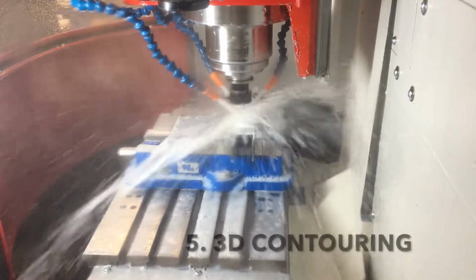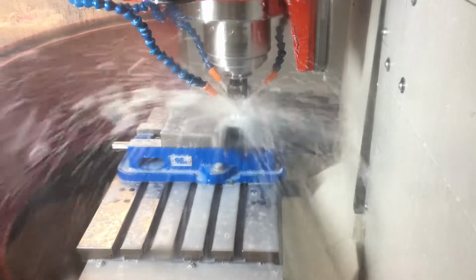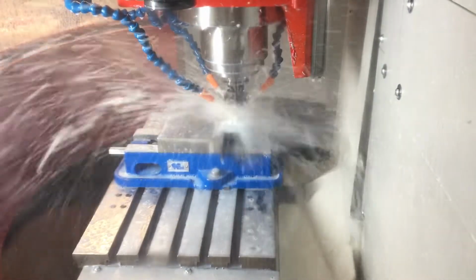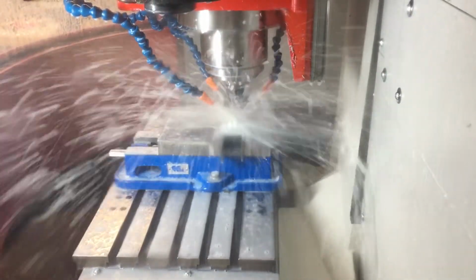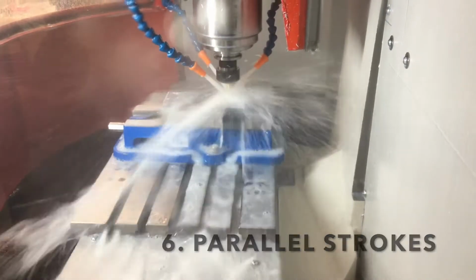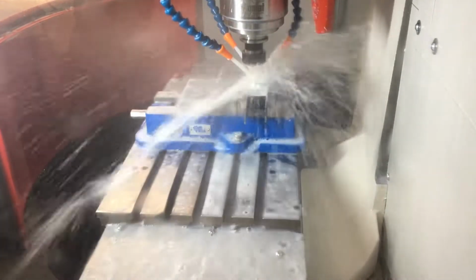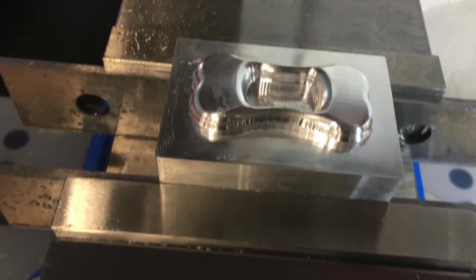Number 5. A ball mill is used to refine the 3D contour shape of the part. The mill moves around the edges of the part profile. Number 6. A ball mill makes parallel runs back and forth across the top of the workpiece. This smooths out ridges and helps the top face merge smoothly into part sides.